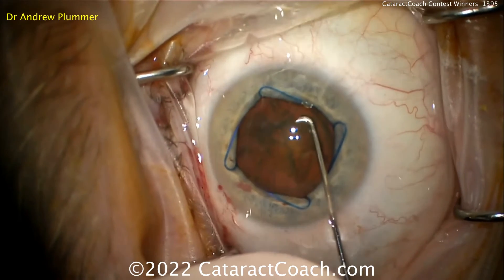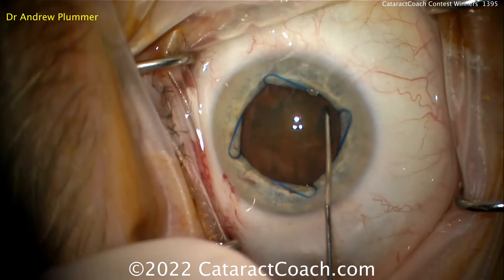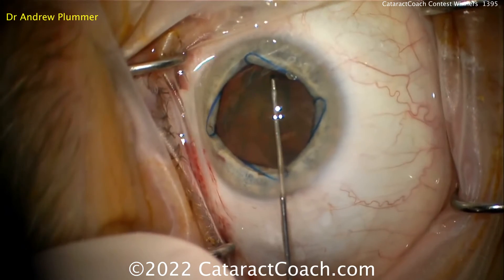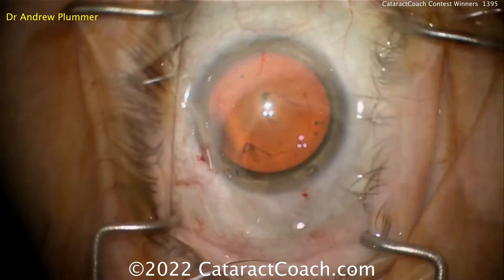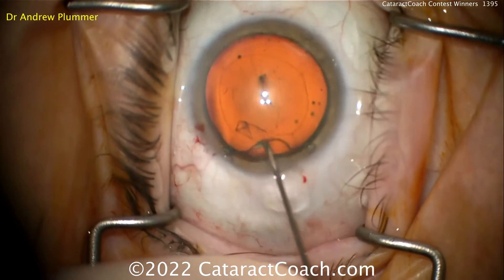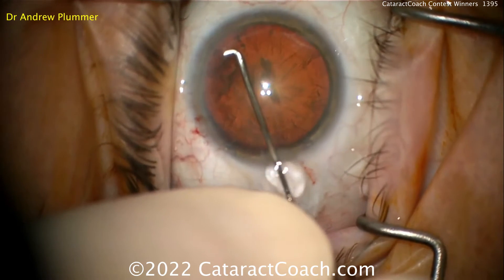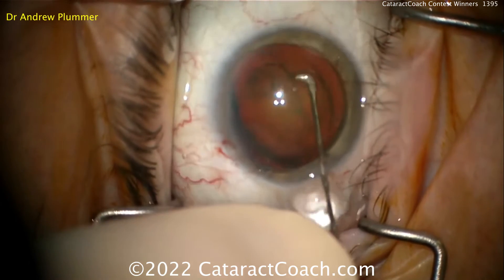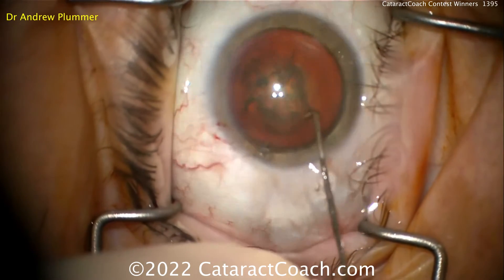The logical conclusion from sending multiple fluid waves is that it's not the fluid wave that allows the lens to spin. There's something else that's keeping the lens from spinning that's not dissected by sending a posterior fluid wave. So we're going to look at what is in fact keeping us from spinning. I think what I'm going to show you is that it's the anterior capsule that really provides a lot of that anti-rotational force vector.